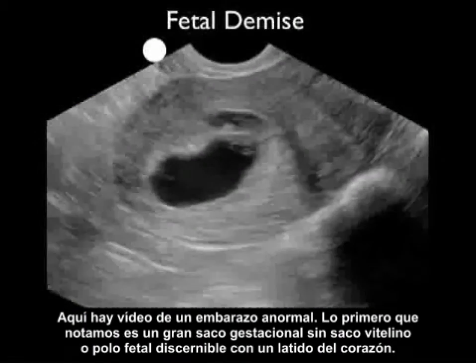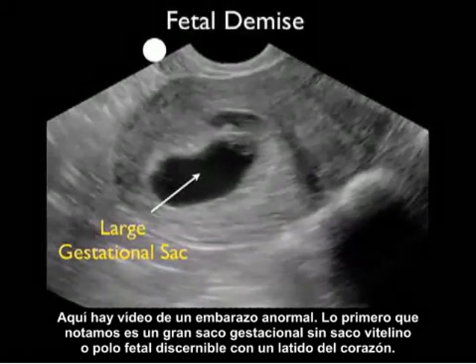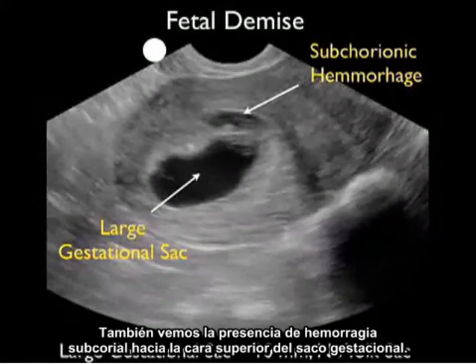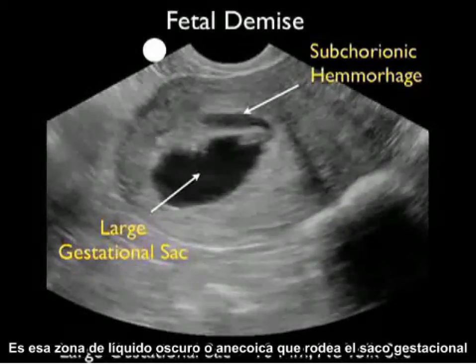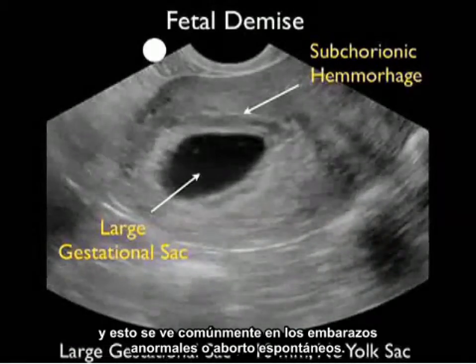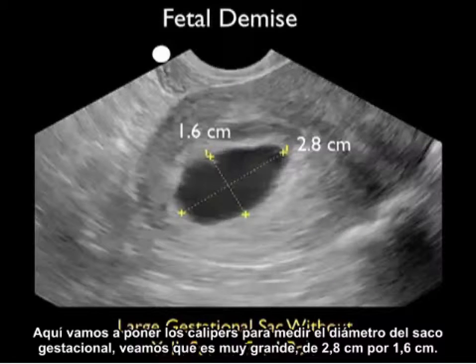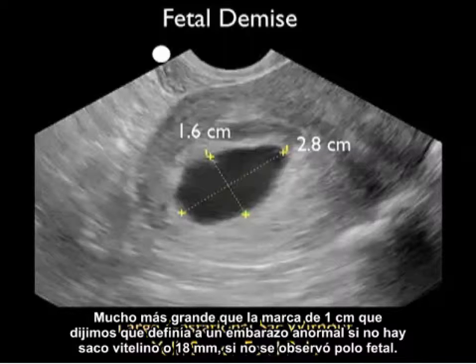Here's video from an abnormal pregnancy. The first thing we notice is a very large gestational sac without a yolk sac or discernible fetal pole with heartbeat. We also see the presence of subchorionic hemorrhage to the superior aspect of the gestational sac — that area of dark or anechoic fluid surrounding the gestational sac — commonly seen with abnormal pregnancies or spontaneous miscarriage. Placing calipers to measure the diameter, the sac is very large at 2.8 centimeters by 1.6 centimeters, much larger than the 1 centimeter mark defining an abnormal pregnancy without a yolk sac, or 18 millimeters without a fetal pole.